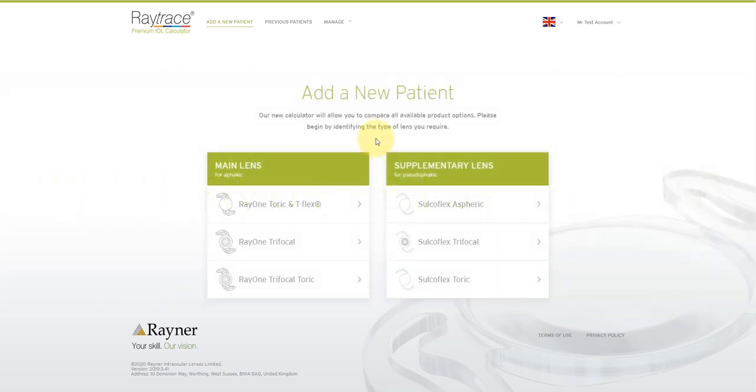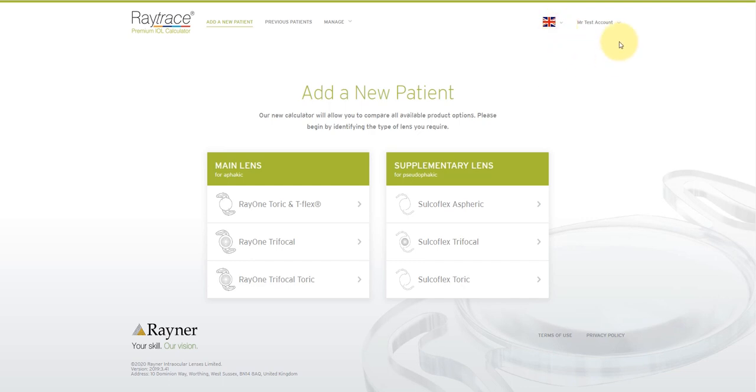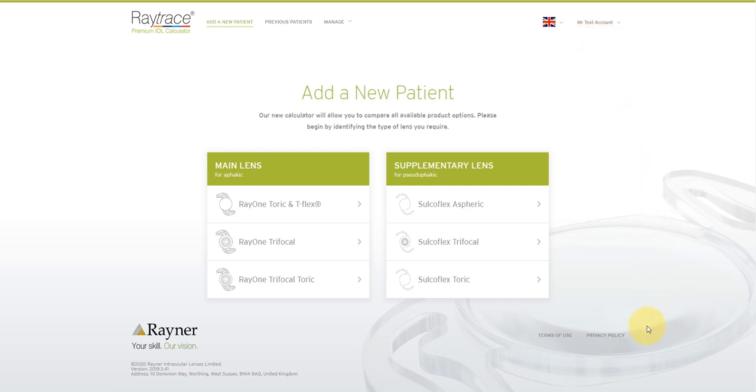From the homepage, you can select your language from the top corner. You can also access account details, including adding your clinics so that you can receive continued support with IOL calculations from your Rayner sales representative or distributor partner. You can view legal notices in the bottom right corner.